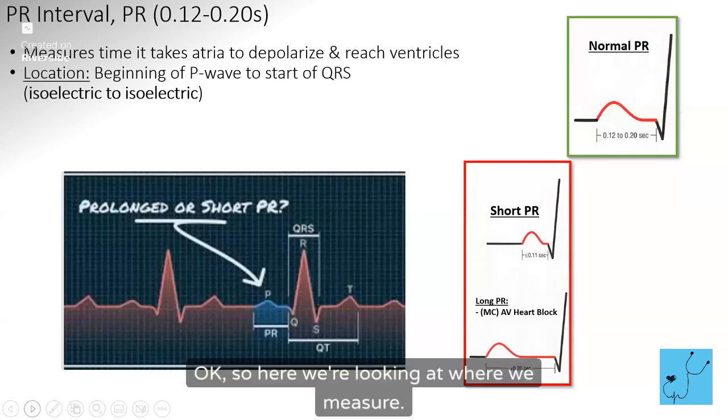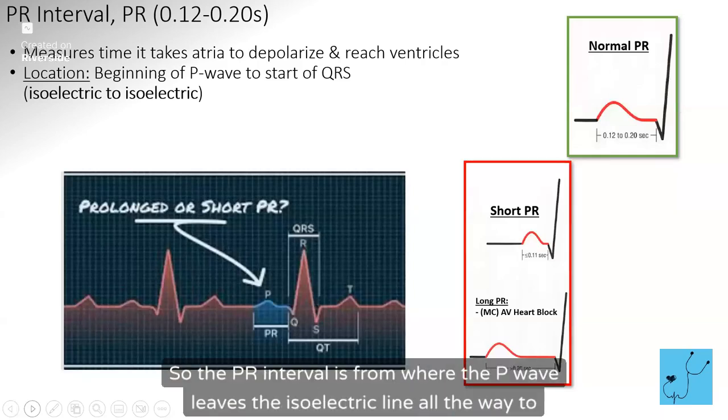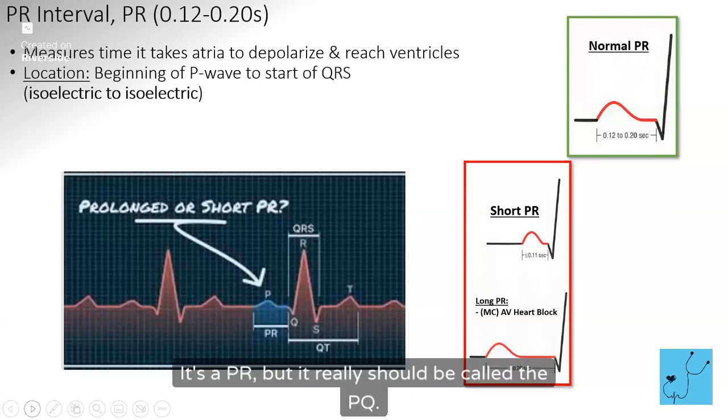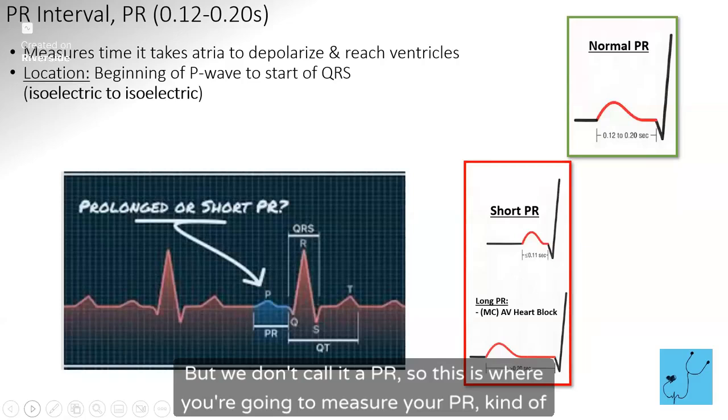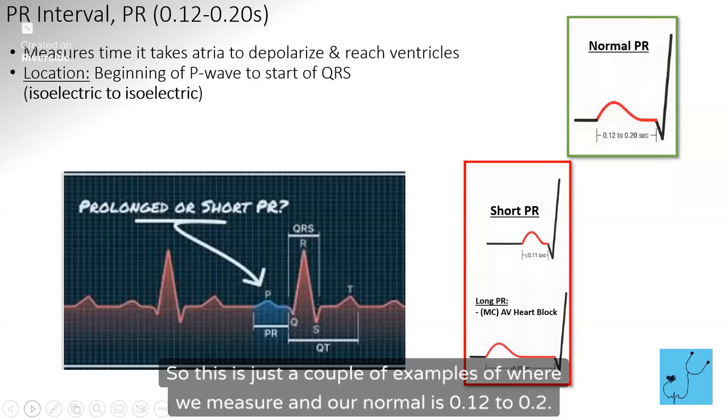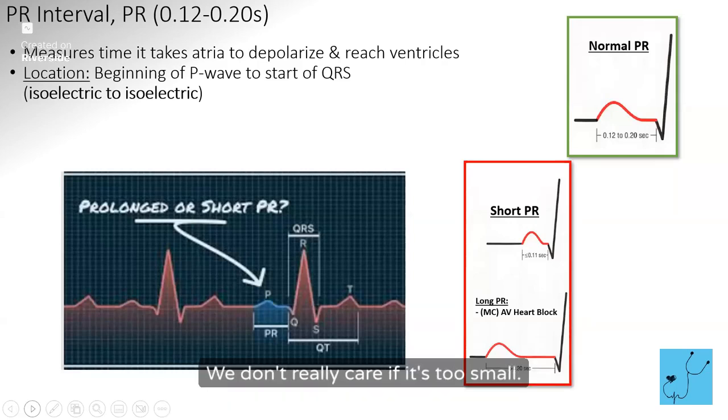Okay, so here we're looking at where we measure. The PR interval is from where the P wave leaves the isoelectric line all the way to the Q. It's a PR, but it really should be called a PQ, but we don't. We call it a PR. So this is where you're going to measure your PR, from where your P starts to where your QRS starts. So this is just a couple of examples of where we measure, and our normal is 0.12 to 0.2. We don't really care if it's too small. We really only care if it's greater than 0.2.